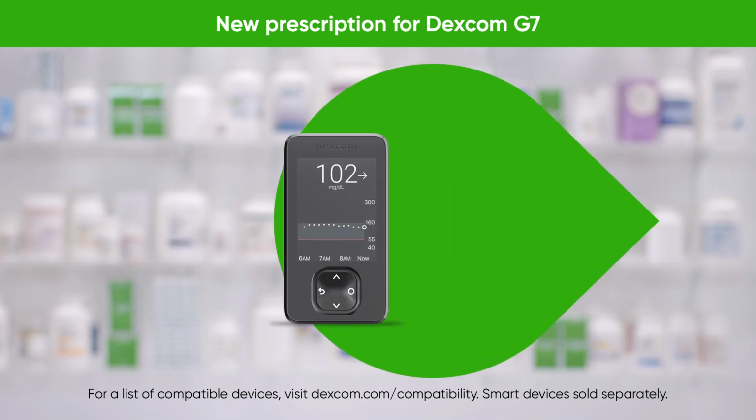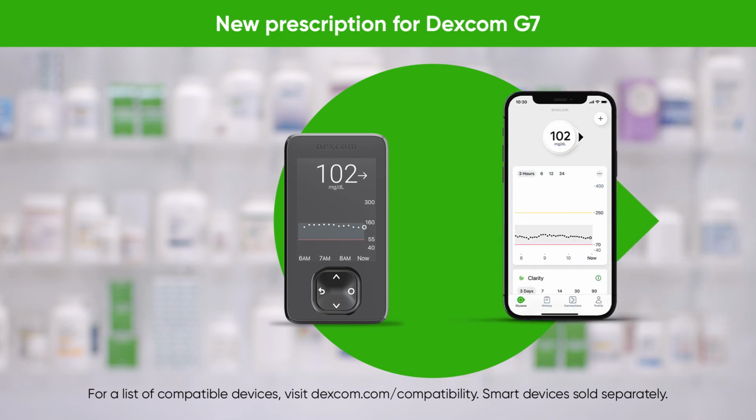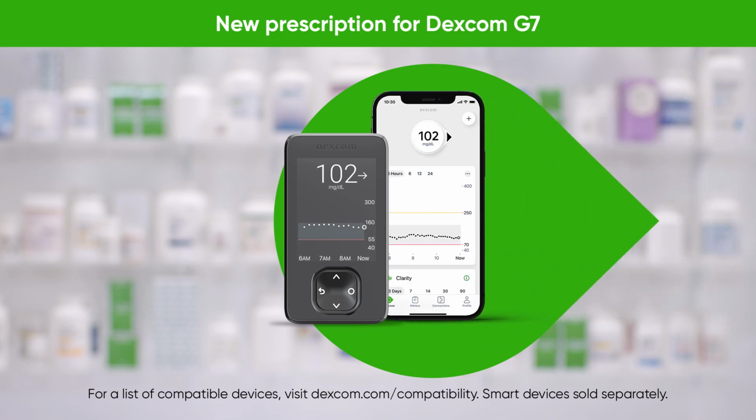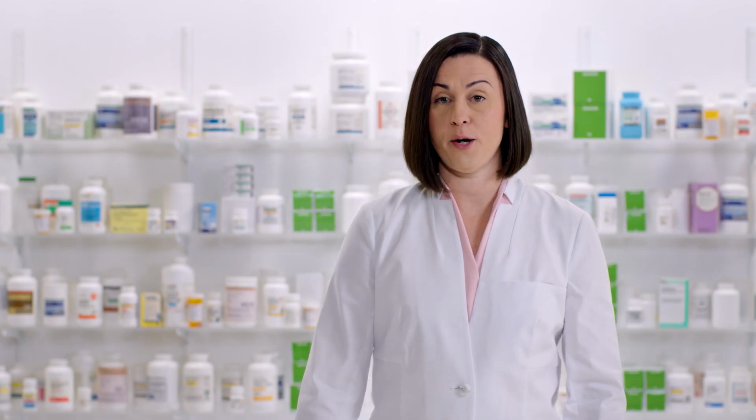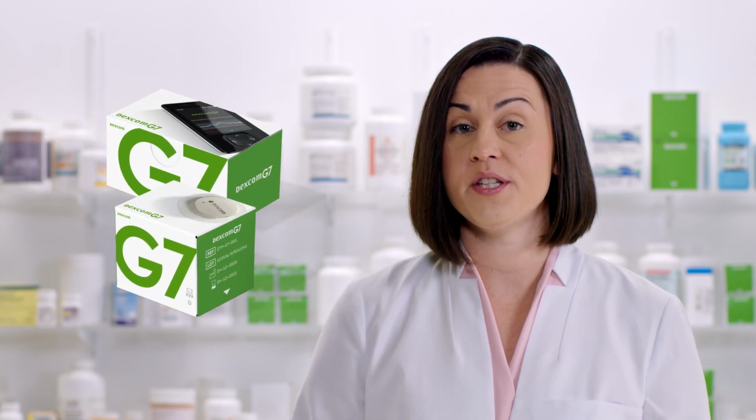The receiver is a display device that shows glucose levels and trends. Some patients may opt to use a smart device in place of the receiver. If a smart device is used in place of the receiver, only the sensor boxes for Dexcom G7 need to be dispensed to the patient. The receiver is not optional for Medicare patients. Medicare patients will need both the sensor box and the receiver box.